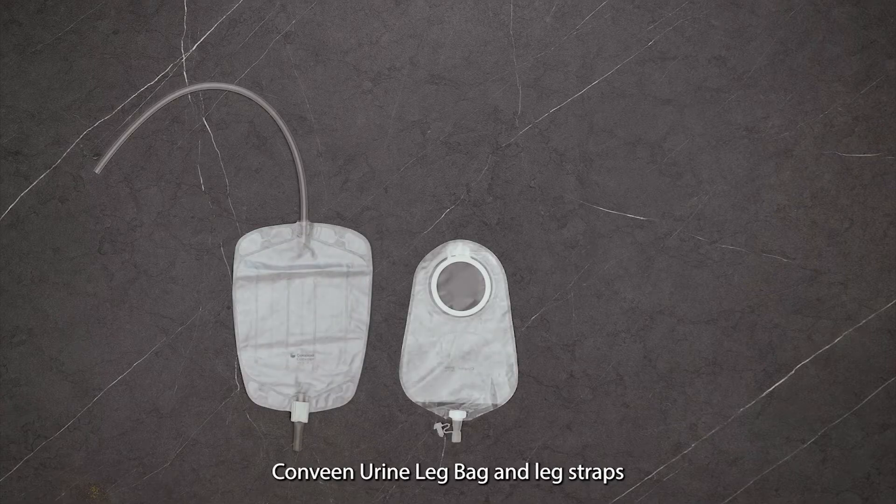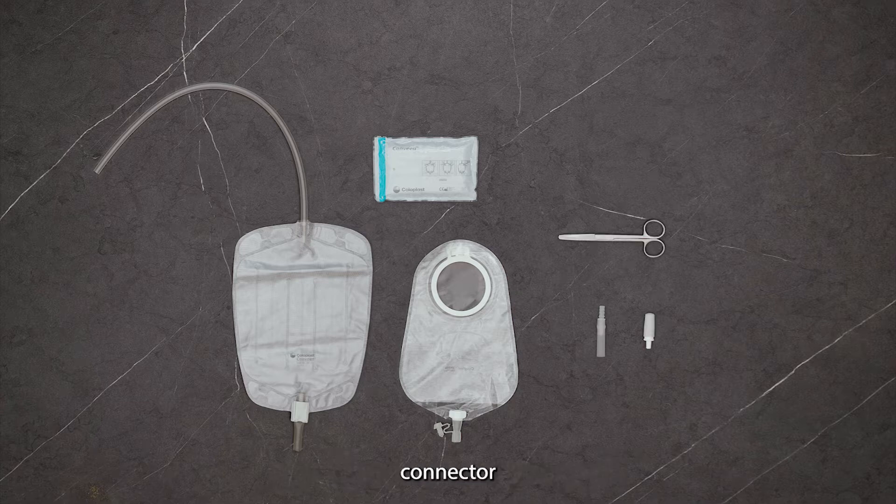Before we begin, conduct this application in a clean environment and prepare the necessary materials: CONVENE urine leg bag and leg straps, scissors, and connector.